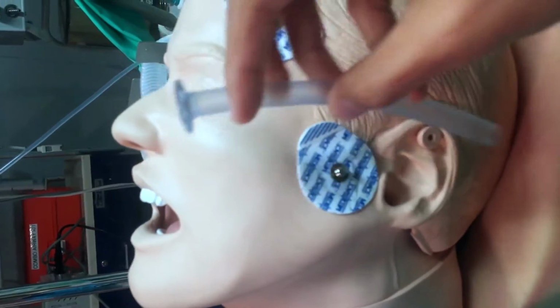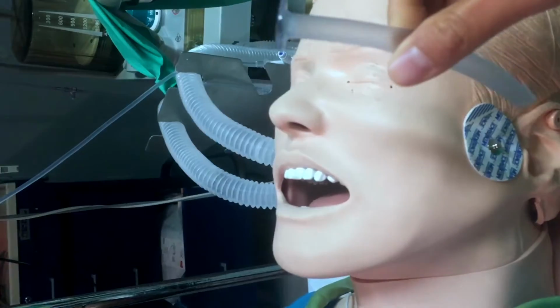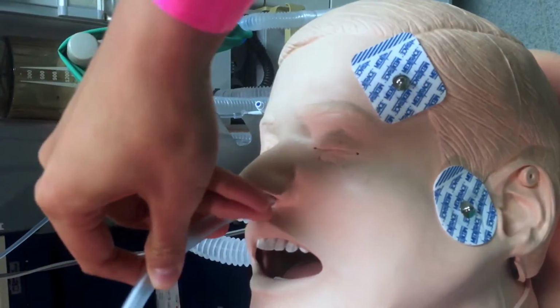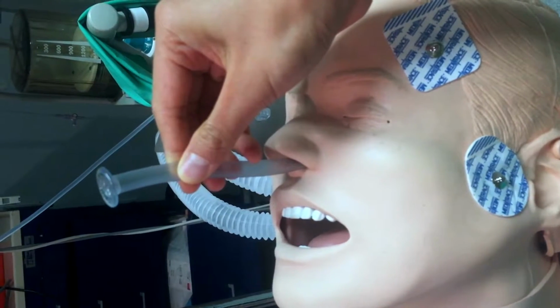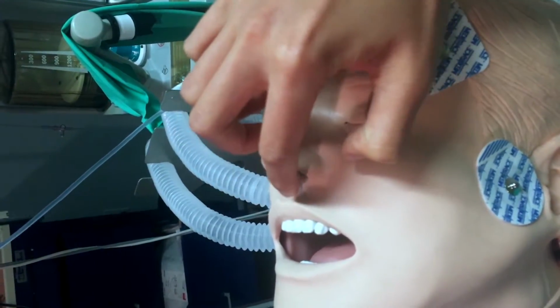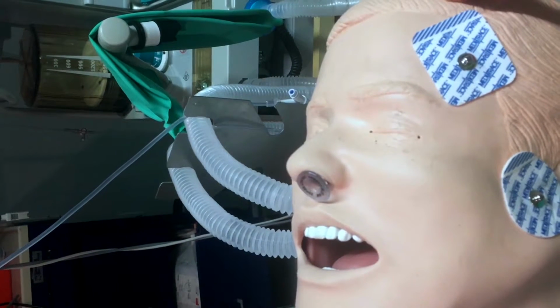Okay, cool. So before you put it into the patient's nare, you make sure it's well lubricated so that it goes in smoothly. You want to insert it at a 90 degree angle, perpendicular to the patient. And then once you put it in, this flange part should rest against the nare. That's how you put it in.